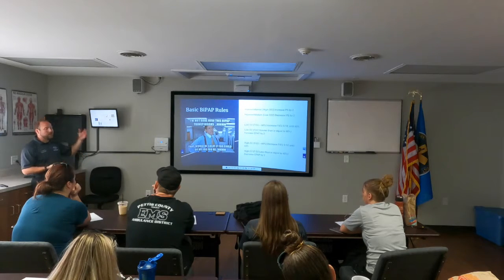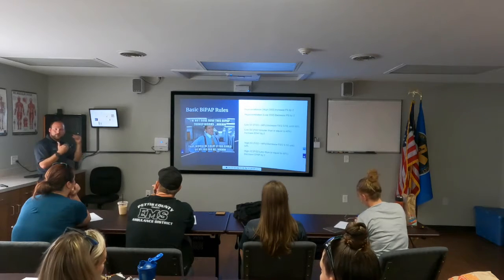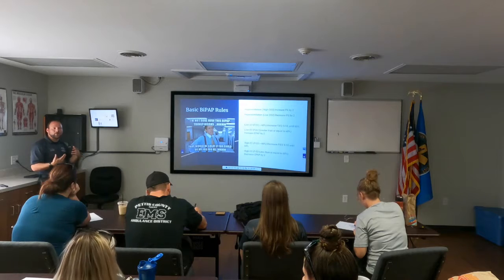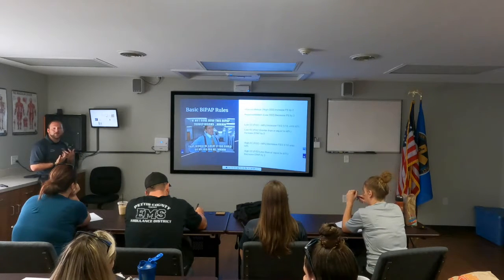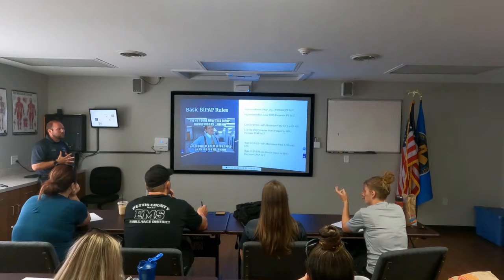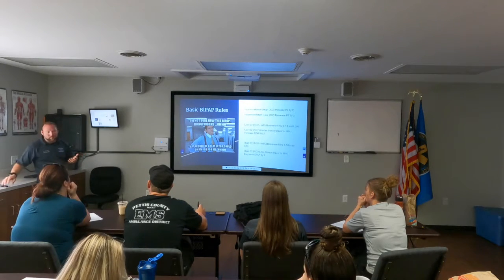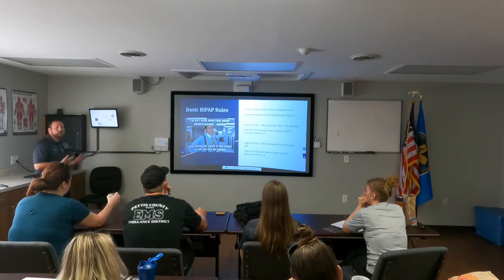And again, depending on how large of a difference between your pressure support and your PEEP, or your IPAP and your EPAP, the greater volume the patient is going to experience when they initiate that breath. Right. So if you need a higher tidal volume, your gap would ideally be 10. Again, what we also want to think about is what kind of respiratory failure does this individual have? Is it type 1 or type 2?